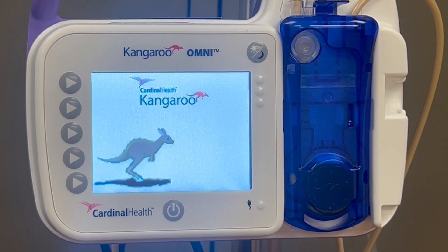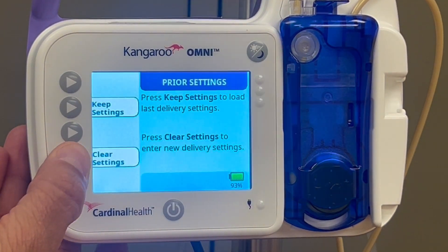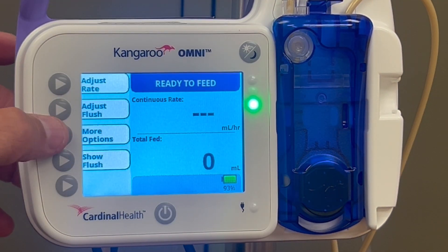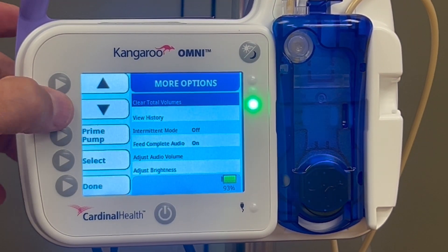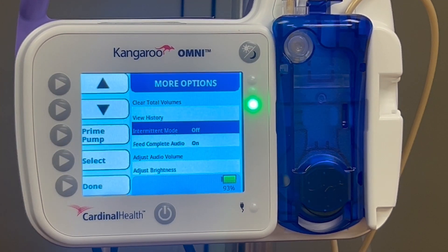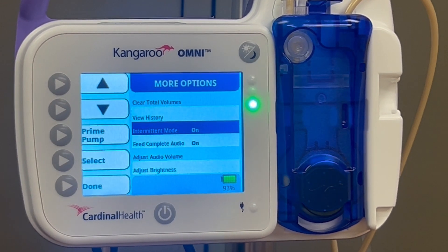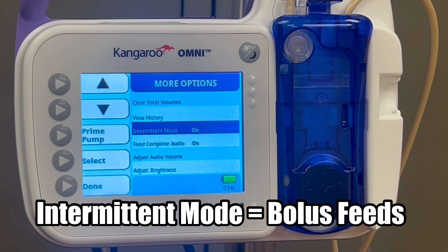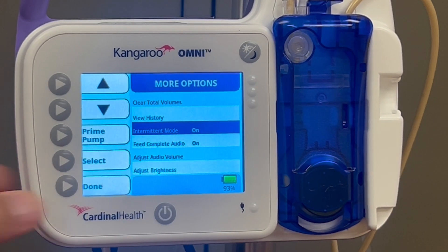With your tubing set up and attached, and your bolus order information on hand, move to your pump. From the main screen, push More Options. Then use the arrows to scroll down and highlight Intermittent Mode, and change the setting to On by pressing Select. Intermittent Mode equals Bolus Feeds. Push Done to go back to the main programming screen.